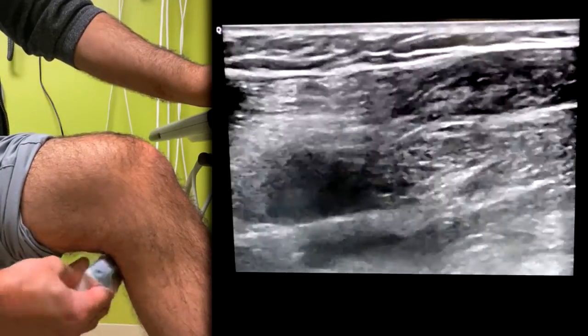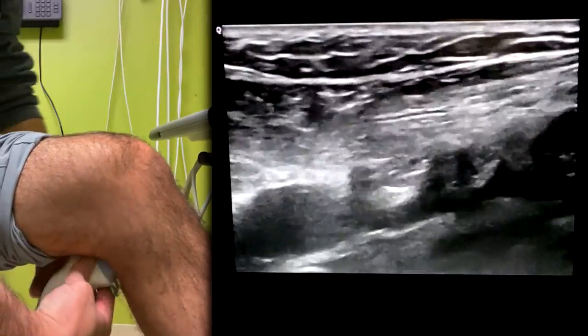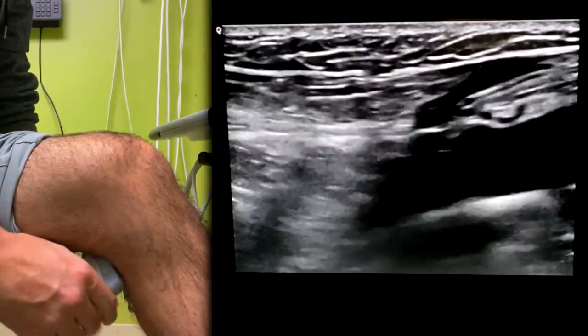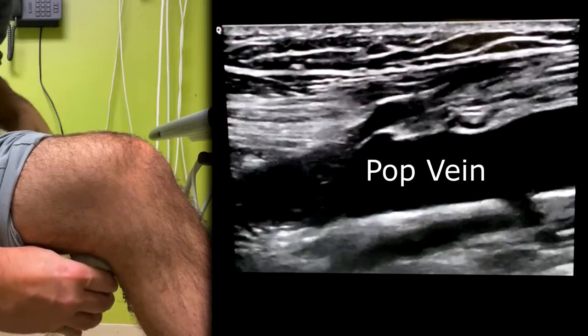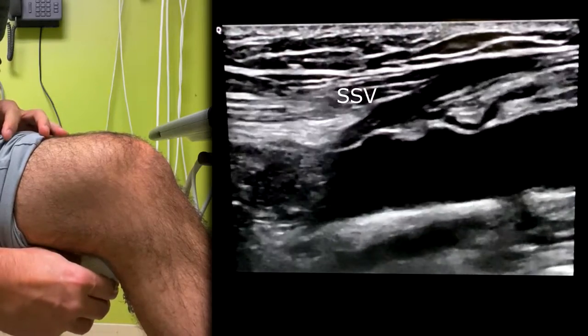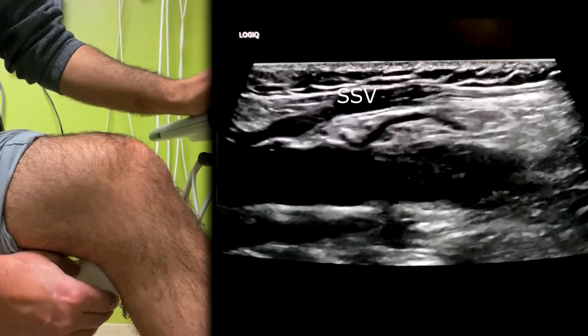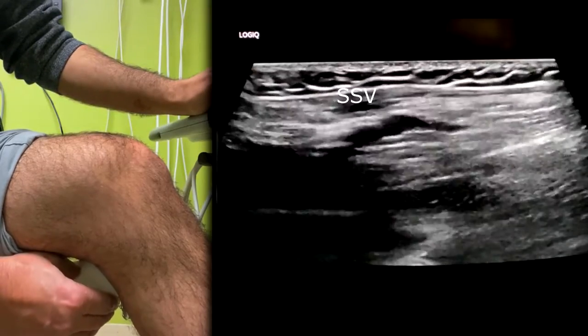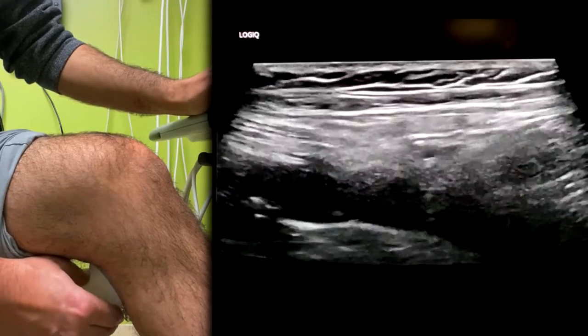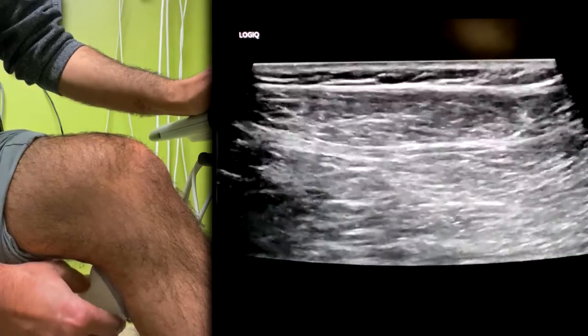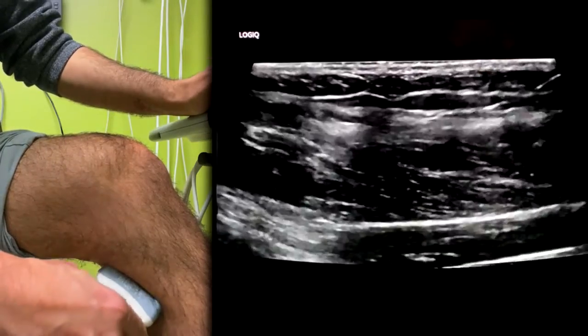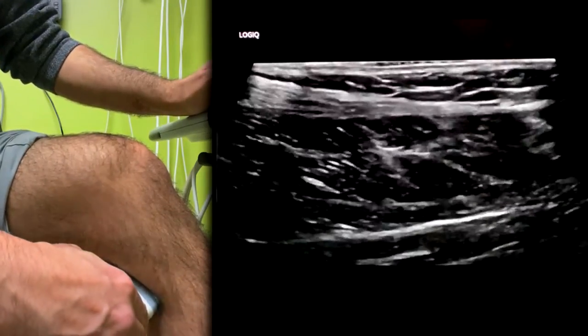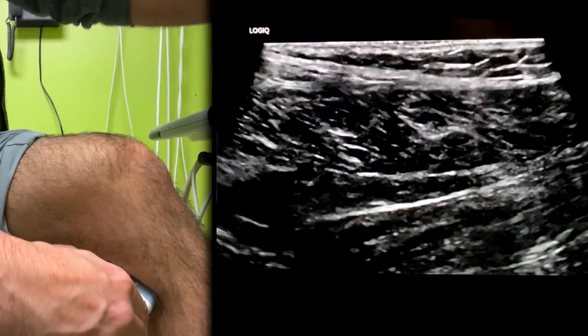You can go sagittal right there. As you go down from here, you're going to want to come medial there in order to get the tibial peroneal trunk.